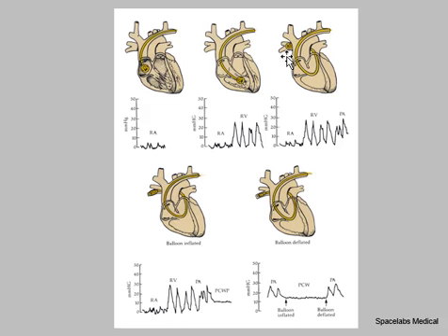Pulmonary capillary pressure is at the level of the capillaries for obvious reasons, and it's not a reflection of the pressure that the Swan-Ganz catheter measures. They're very similar, but they're slightly different physiological measurements. And you can see the wedge.